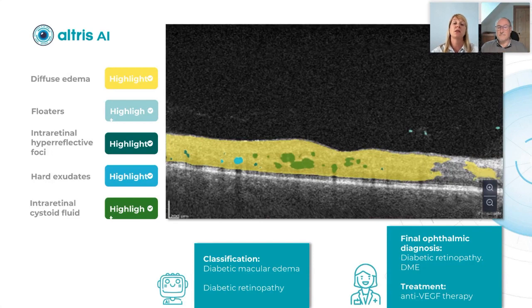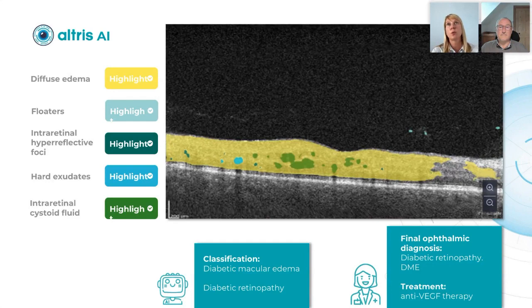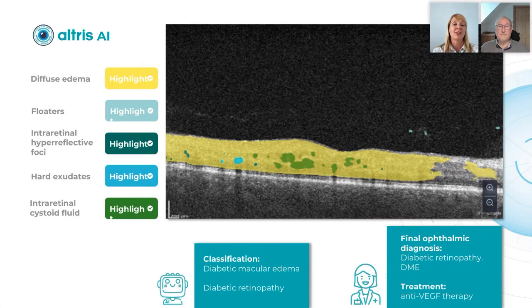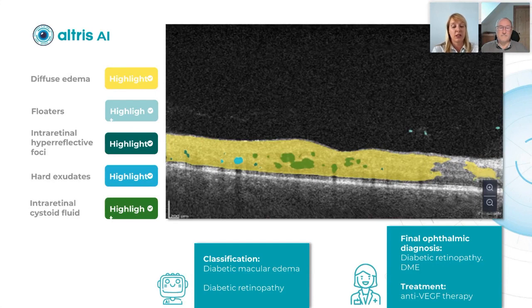These three cases from our real-life practice showed us that AI helps us not to miss pathologies, even in early or asymptomatic stages. It shows how different pathologies look with color coding, which is also part of our postgraduate education, gives us confidence in what we see, and makes our work more efficient.